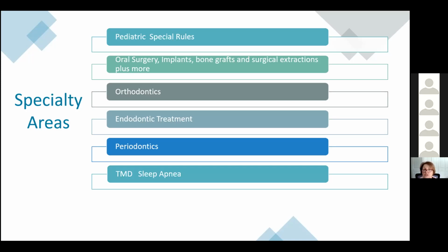Orthodontics has always used a 2D radiograph, but we are now seeing more orthodontics than ever utilizing 3D scanning. Endodontics has added 3D scanning onto their policy as a standard of care, because they have seen that there are more patients getting endo that end up in pain or have the tooth extracted.